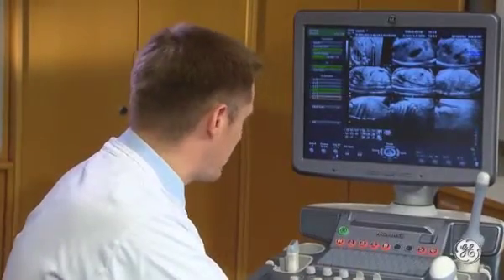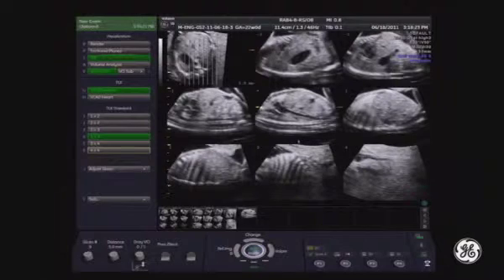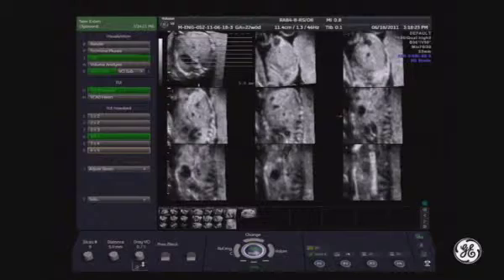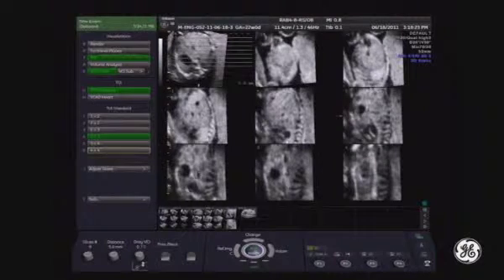Several years ago, Professor Achiron from Israel presented that coronal views are also helpful. So if you need coronal views for checking the diaphragm, you can also do it from one volume. Let's try if it is possible here. So I will select the C plane and I will make it bigger. And let's move these sections a bit. And see the anterior aspect of the diaphragm here, because this is the liver.